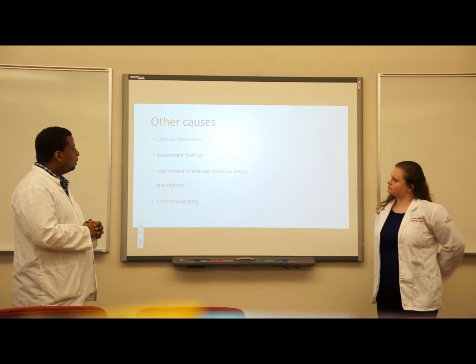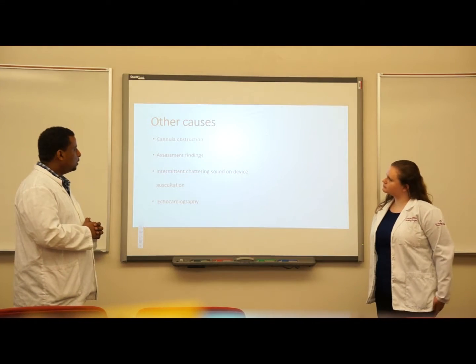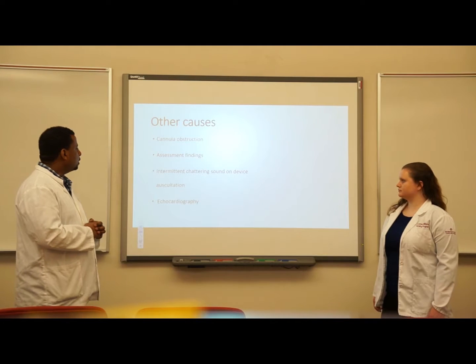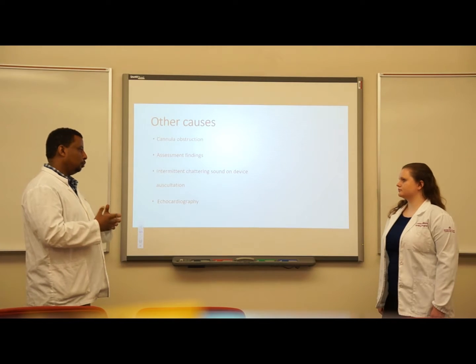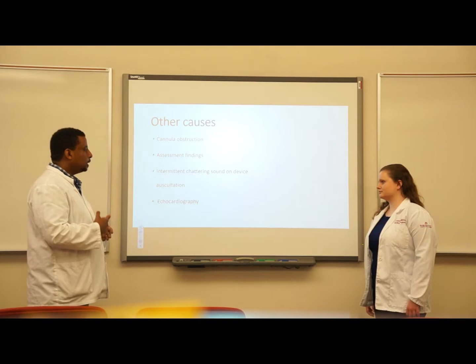Other causes of low flow output include cannula obstruction, and an assessment finding that indicates a cannula obstruction is an intermittent chattering sound on device auscultation. So you pick up your stethoscope, go to the pump, and try to auscultate.